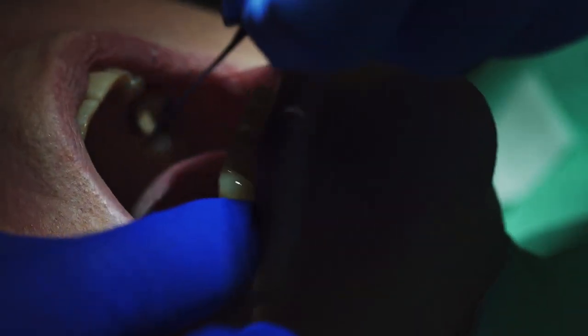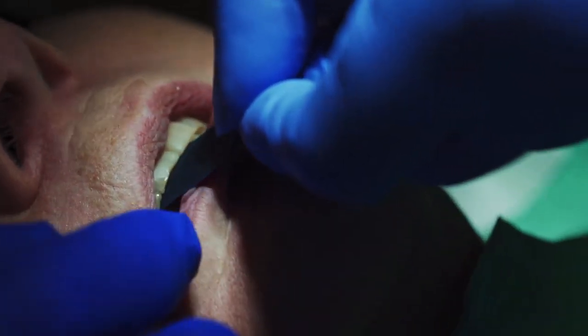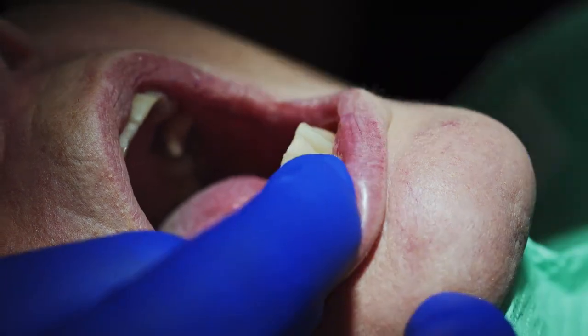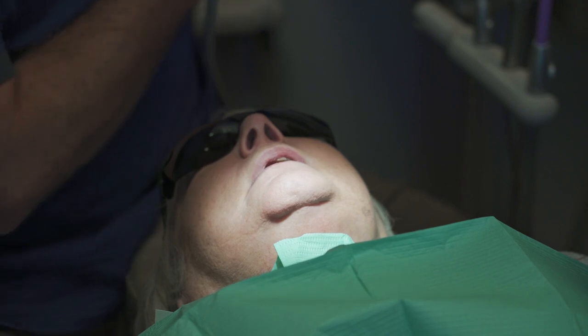I'm just going to have you tap and grind on this paper I have in your mouth. Go ahead and close. Bite and grind. Perfect. Now we'll polish it, and she is done.